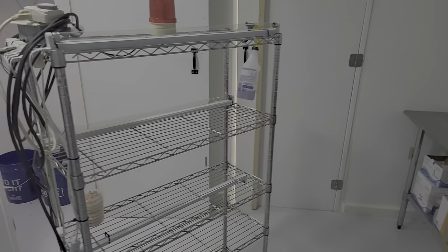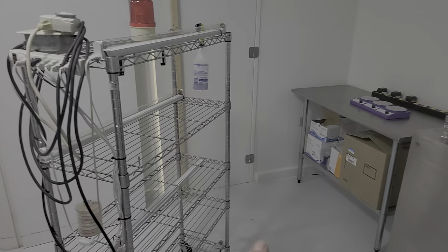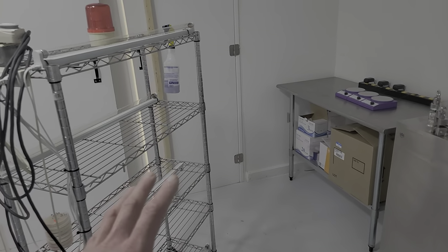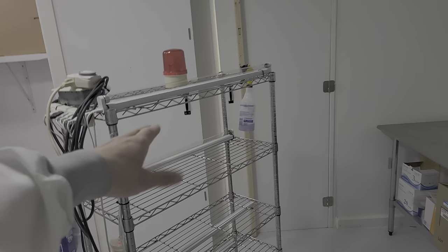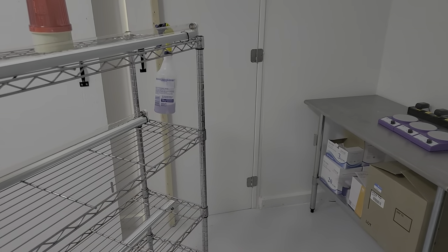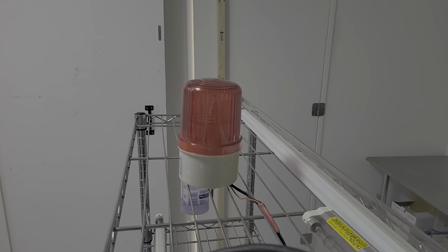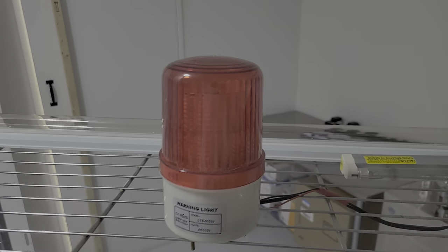Depending on which room I'm treating, I position the cart in different spots because UV is directional — it has to be close to the item being sanitized. And this is sanitizing, not cleaning — the surface must already be clean. I can put it in incubation, the lab, or my other lab and blast it. The multiple lamp tiers reduce shadowing, because a shadow means that area doesn't get sanitized. I also have a loud beacon that flashes so you know when the UVC lamp is on.